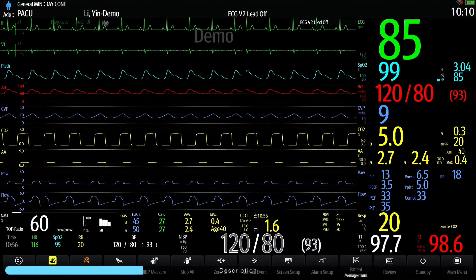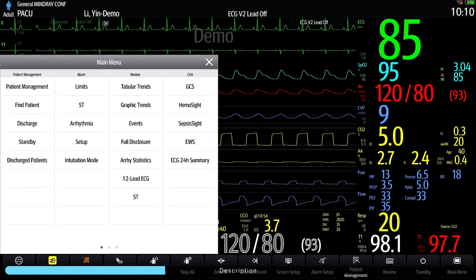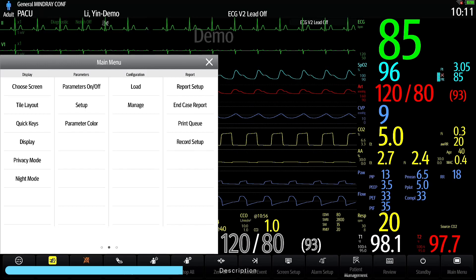With the monitor on, we start by selecting the main menu on the bottom right corner. Swipe the screen from right to left until you get to the system column.